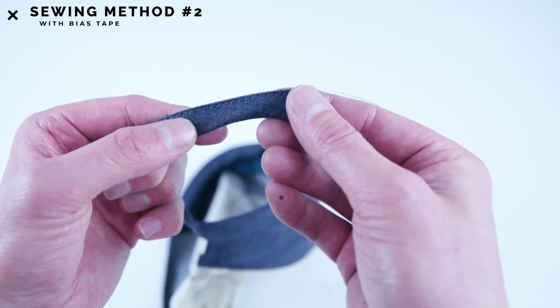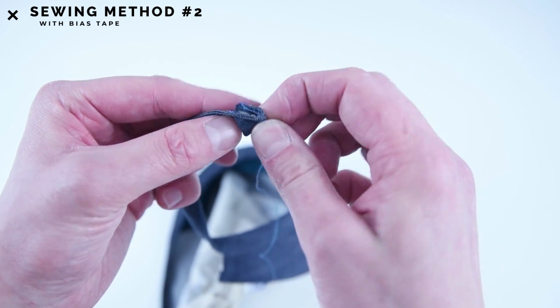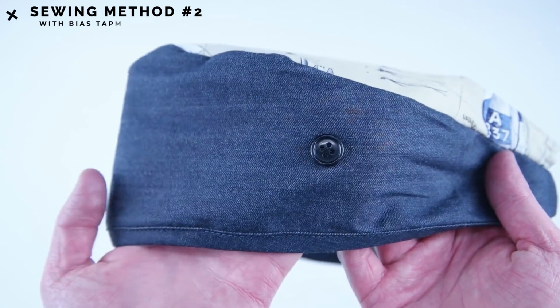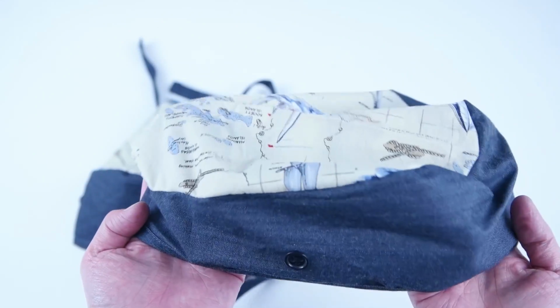And to finish off the ties, just fold the edge over twice and do a tack stitch. And the last step is adding the buttons, and this is going to be different for everyone. I recommend putting the cap on and feeling where your ears are and then making your marks. Once you have your marks made, you can hand sew your buttons on.